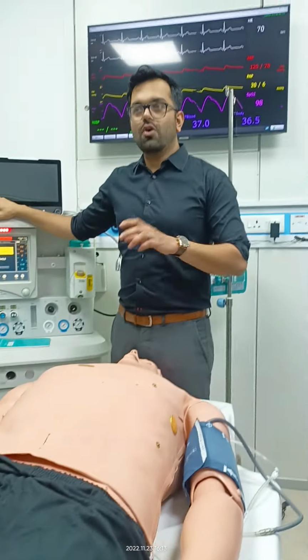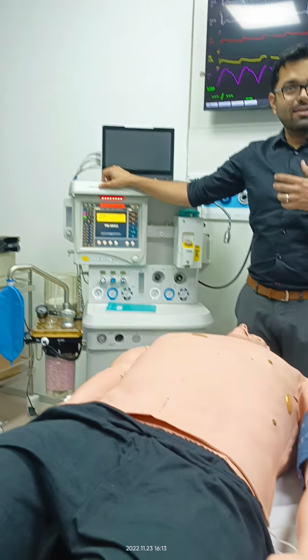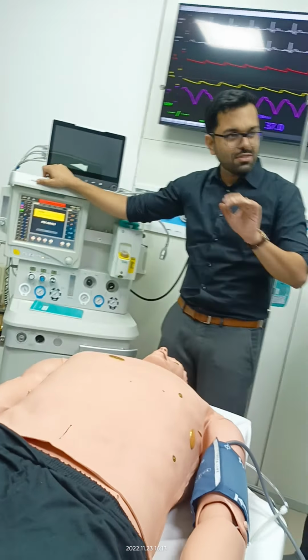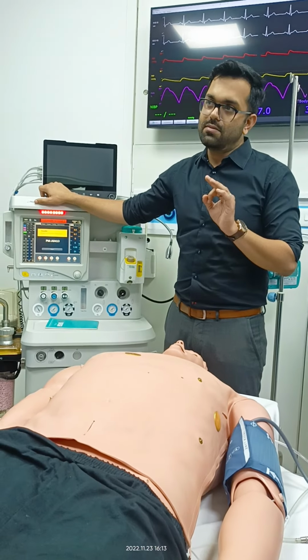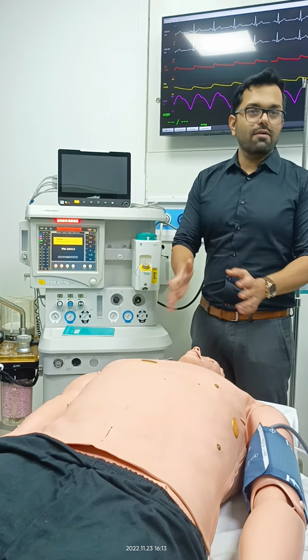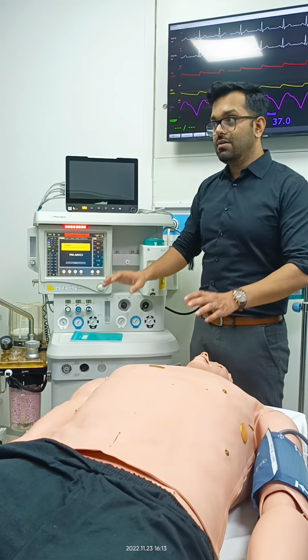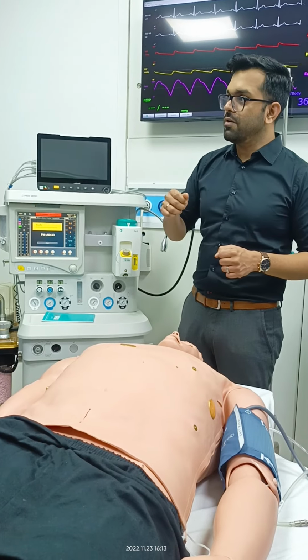And we call it workstation. It basically takes away all our stress. It does everything for us: monitoring, giving anesthesia, maintaining anesthesia. It has a built-in ventilator also, which takes care of the breathing of the patient. So I really don't have to do anything. Once the patient is intubated or on ventilator, I literally have my hands free. If the patient is fine, I can have a sip of coffee also.